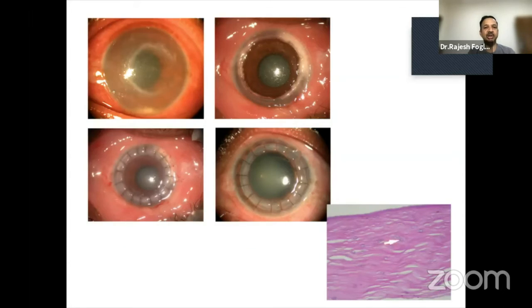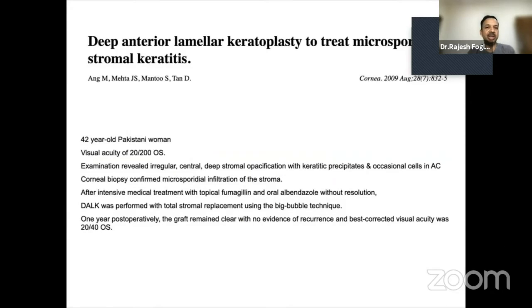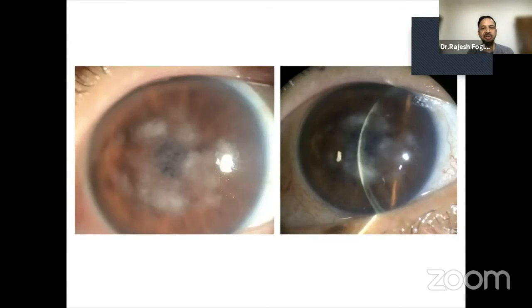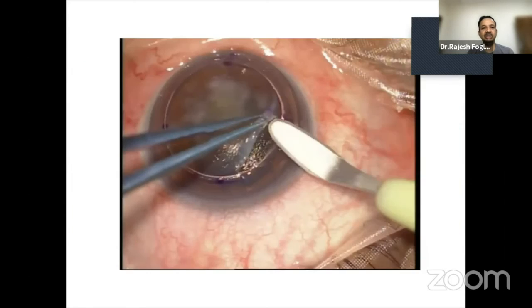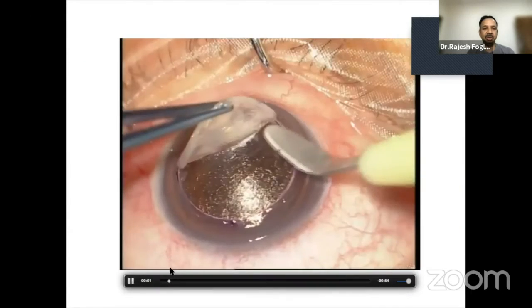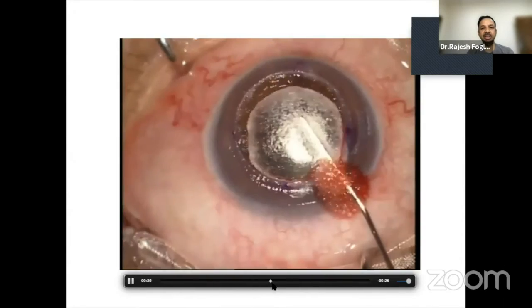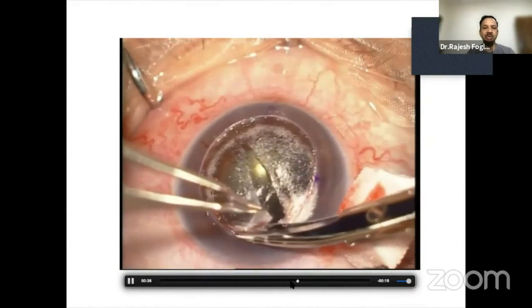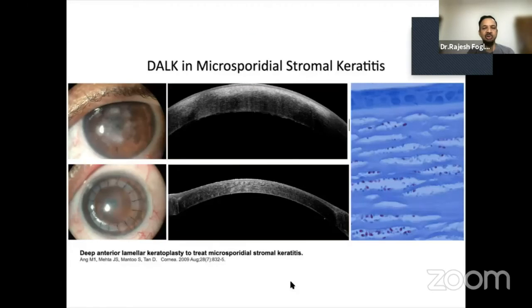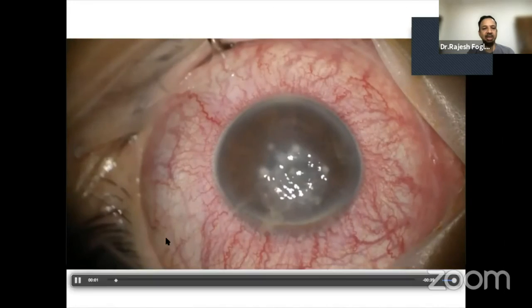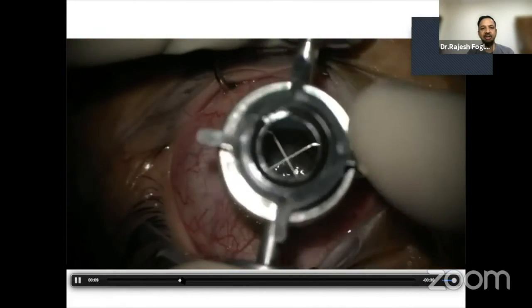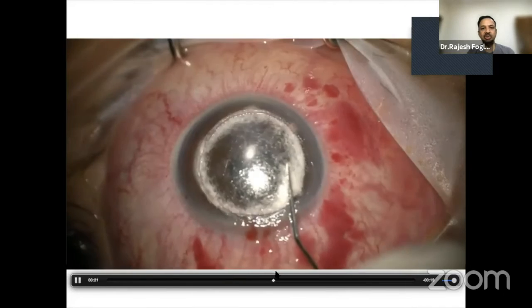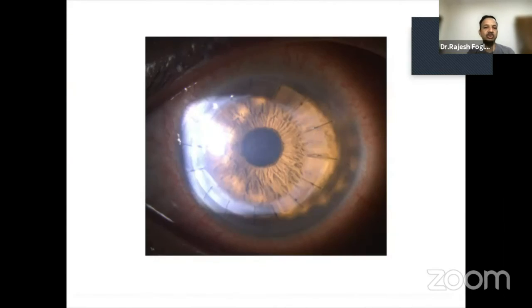There's another case with non-responding Acanthamoeba keratitis that was successfully managed using DALK. Similarly, for microsporidial keratitis, where we don't have effective therapy, DALK can also be used. A patient with non-responsive treatment underwent big bubble DALK with a successful type 1 bubble. The advantage of big bubble is it removes all the residual stroma, thereby eliminating all infected tissue from the cornea. There was also a patient who had LASIK performed and then developed infective keratitis, where big bubble DALK was performed with a good post-operative outcome.